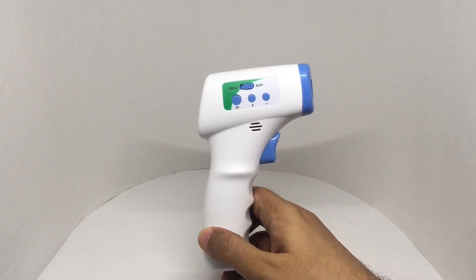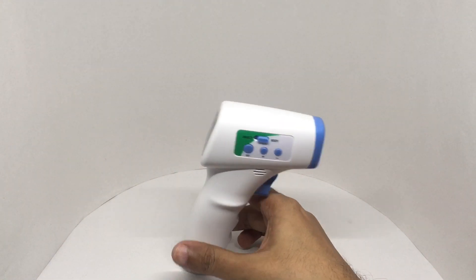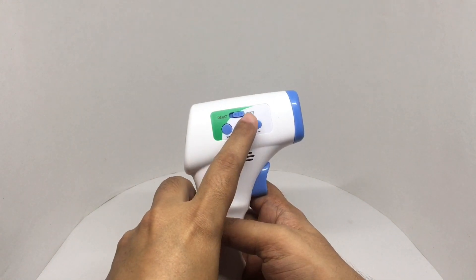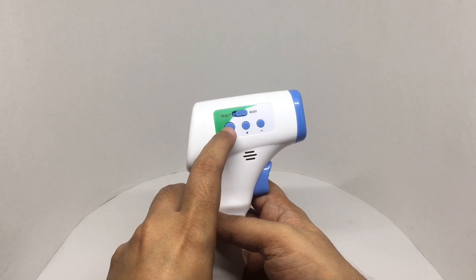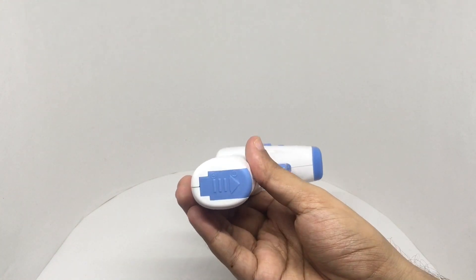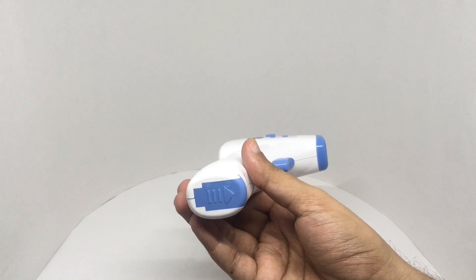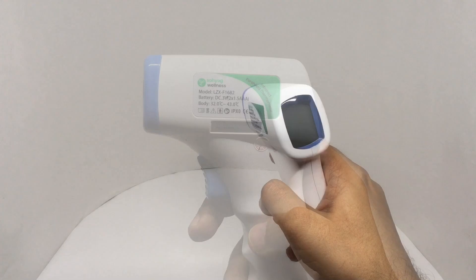Here's how the device looks — it cannot stand on its own. There's a switch to choose between object and body modes, along with buttons to change settings and recall previous readings. Also worth noting: rechargeable batteries didn't work with it — it needs Duracell or something similarly powerful.